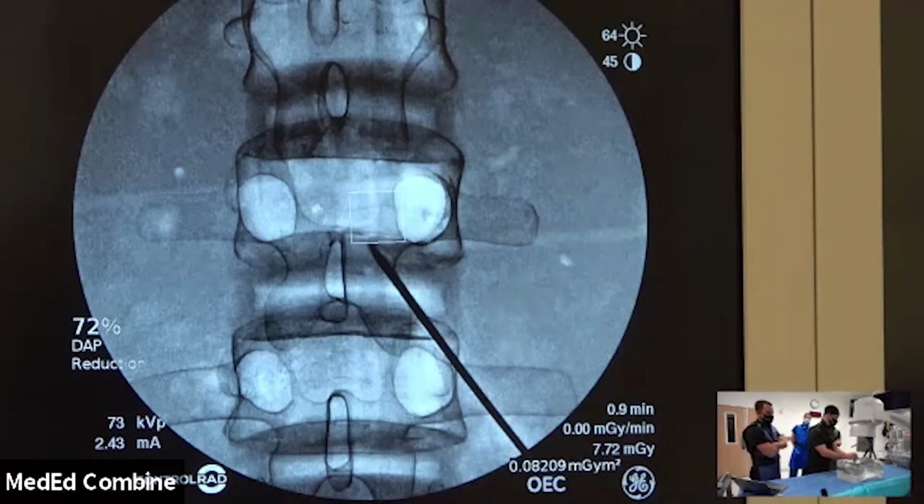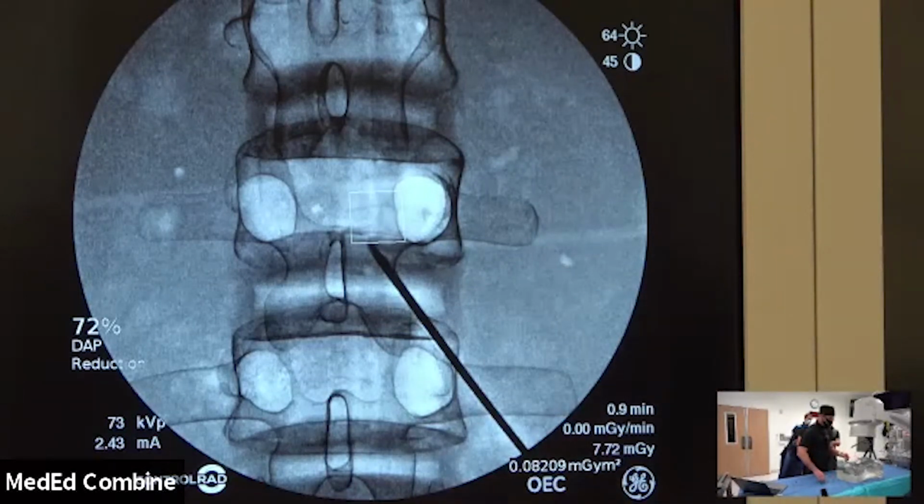So then you come in with your lead. I guess we could put it in if you really wanted it. You could. Let's see where this is. I have to go just a tad further. In a real model, it would be in. It takes just a little bit more.